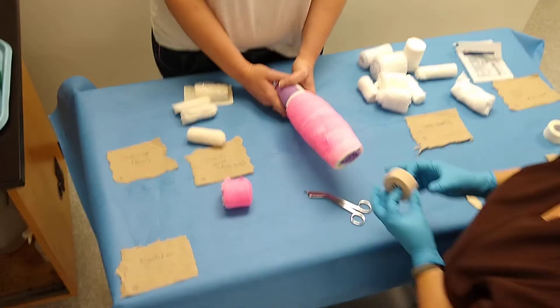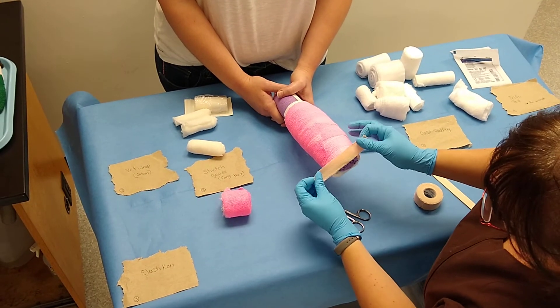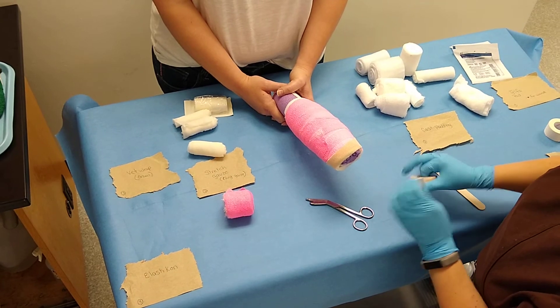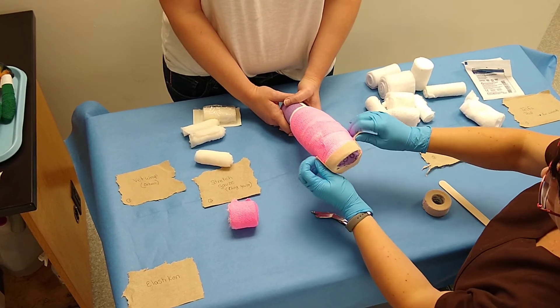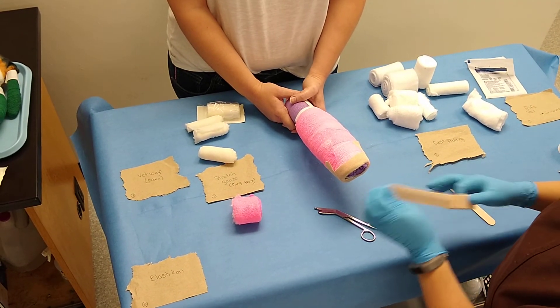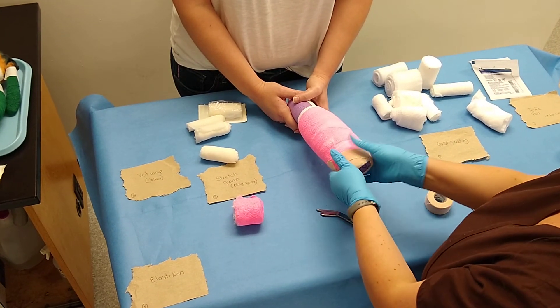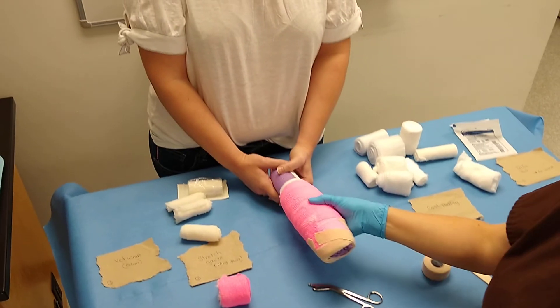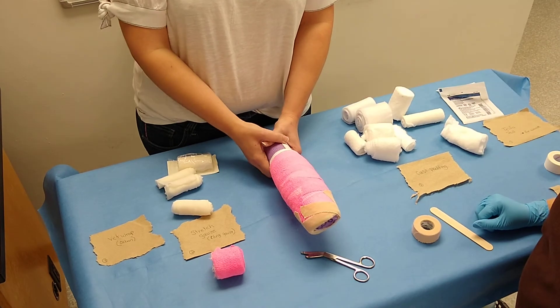Your elasticon is last. You're going to place the elasticon over the edges to protect the bandage when the dog walks on it. Now you can see your dog's toes at the end of it, and it's still thick enough to give protection. And there is your modified Robert Jones.